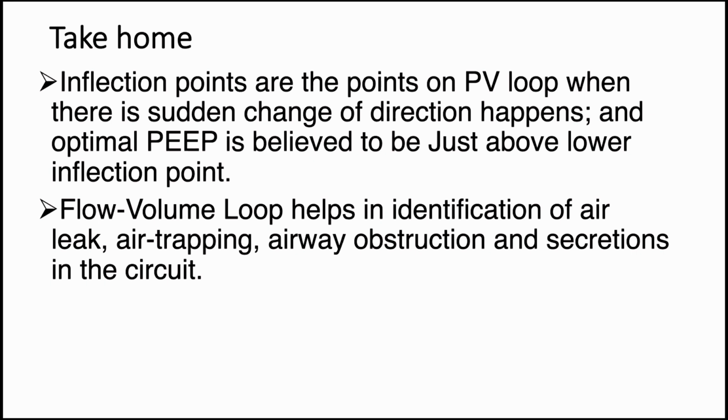So though it has been very seriously considered, many people believe that it just shows some recruitability of the lung. They believe that if you can get a proper pressure volume loop and the lower inflection point is very clearly seen in your graph, that shows that in that particular patient the ARDS is probably more recruitable. If the lower inflection point is not well seen, the lung is unlikely to be recruitable. So rather than explaining the optimal PEEP, the pressure volume loop may help find out the recruitability of the lung. That is what it is.